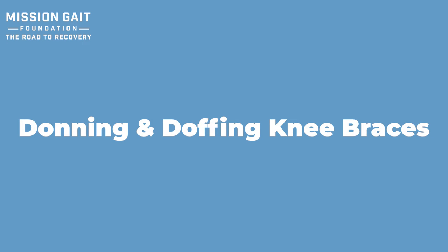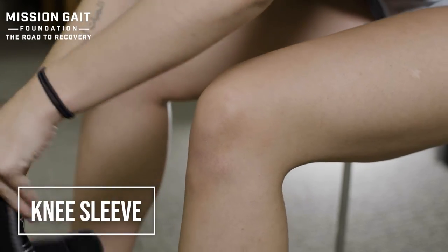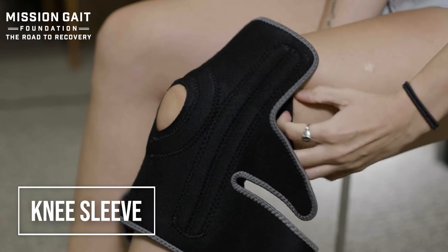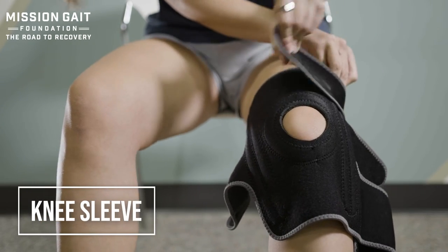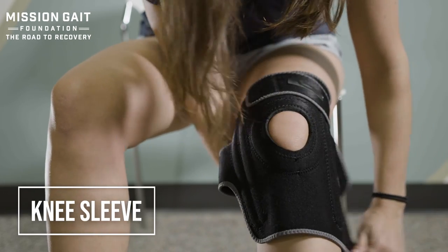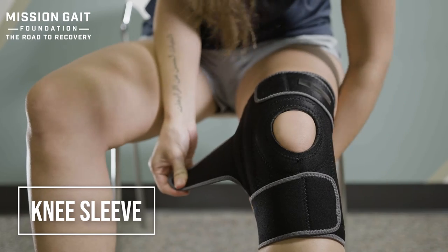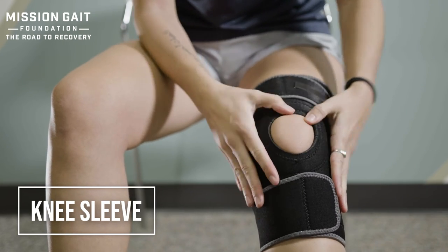Now we're going to talk about donning and doffing knee sleeves and braces that are more off-the-shelf products. We're not going to talk about product names — simply identifying types of braces and tips on how to don or doff them correctly. The first is the knee sleeve. It can be a slip-on or a Velcro closure. These are open patella, meaning they take compression off your kneecap. Pulling up until the top of the kneecap fits fully inside the patellar opening is really important. The Velcro closure is nice because you can adapt to someone with a different calf size versus thigh size.